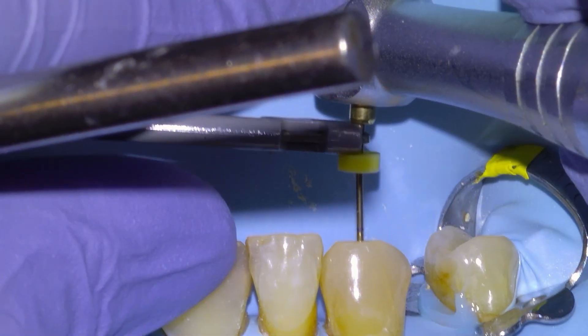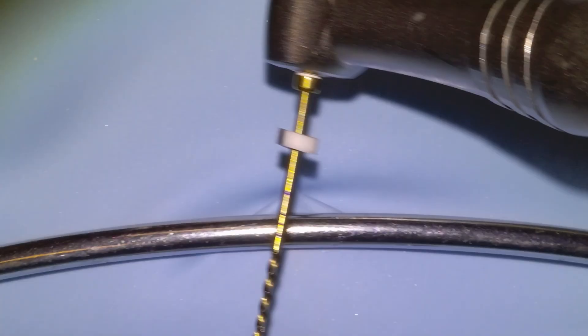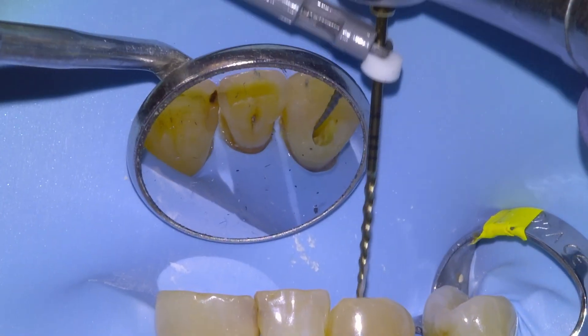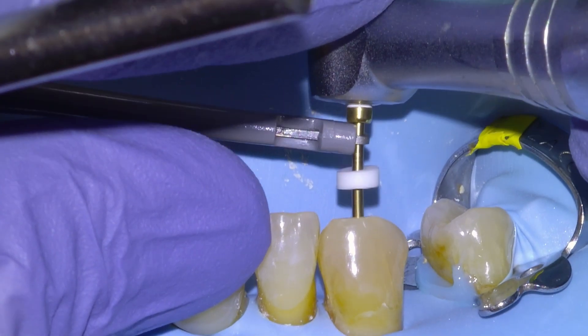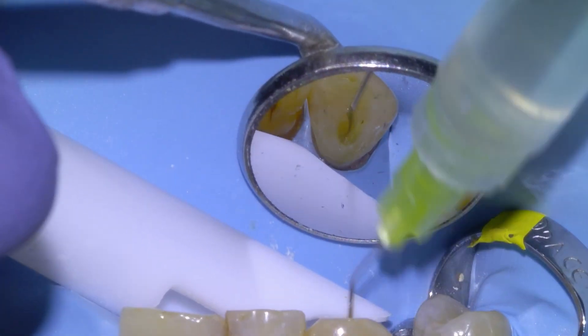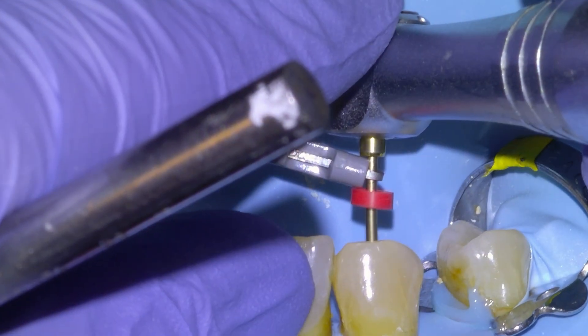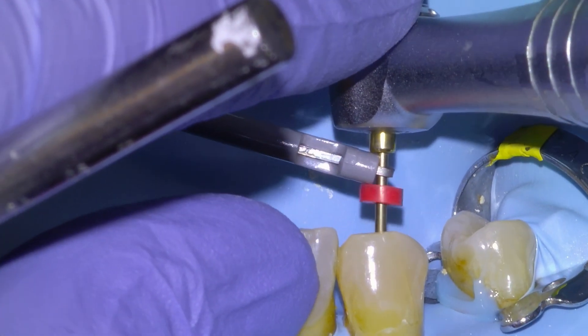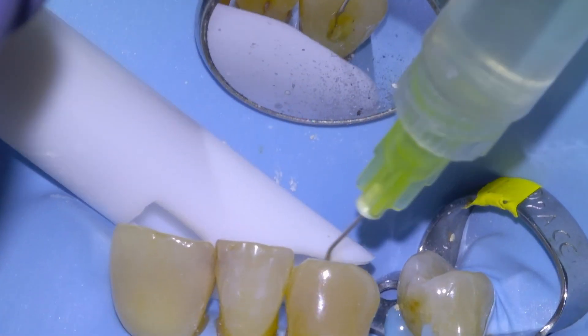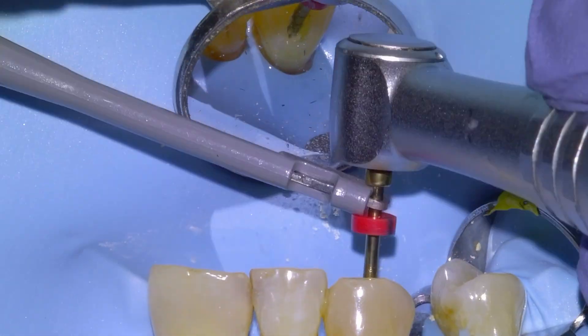We irrigate with full-strength hypochlorite and then begin taking our files down to length. I clip the apex locator right to my file and it will alert me when I'm at apex. I'll take the glide path file down to the red line to ensure patency, then take the shaping files down to the green line. This is a 15/04, then a 25/04 — these are heat-treated files so they're very flexible. I use them once, as separations happen but are fortunately pretty rare. This is a 25/06 taken to the green line.